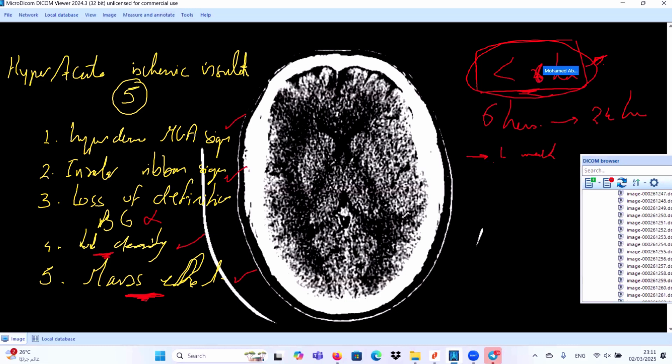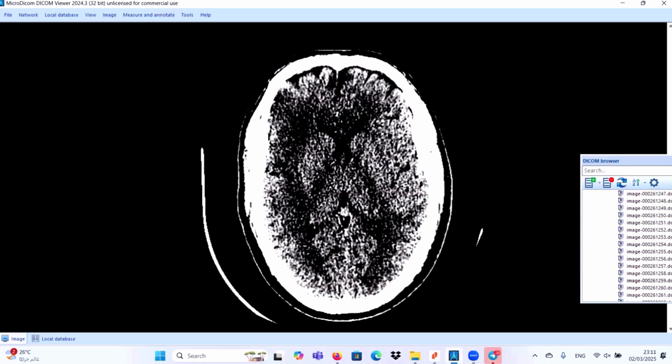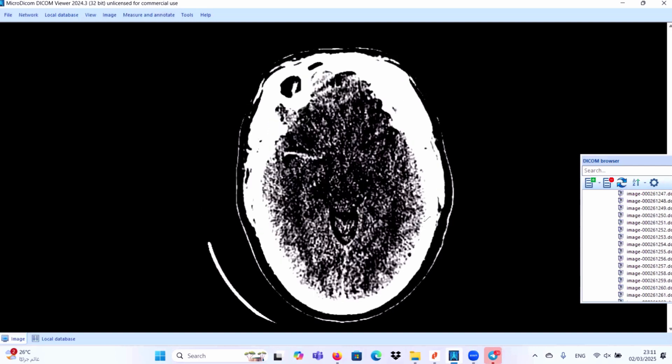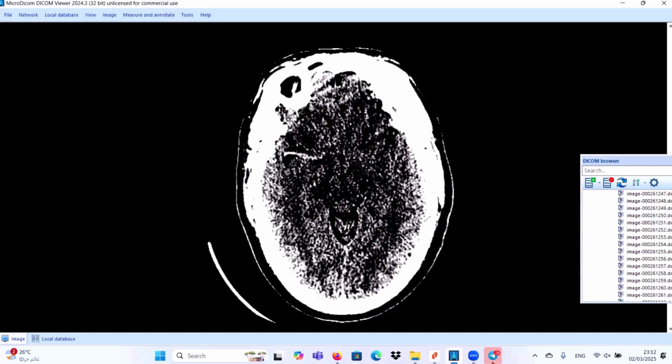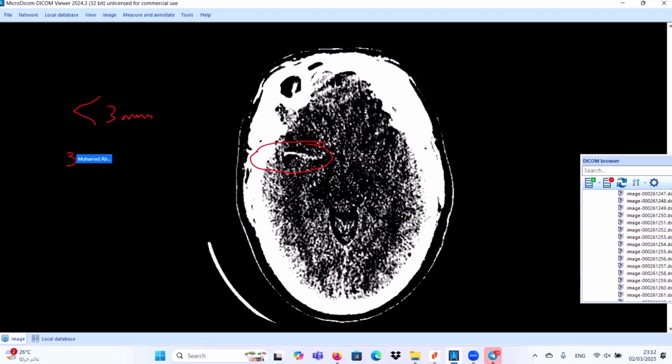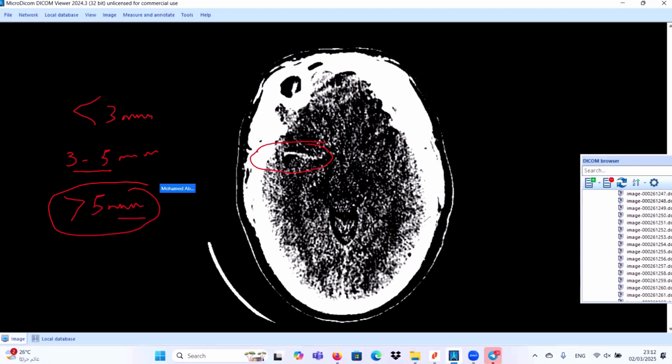Our two learning points or two secret points for highly professional reports: you can measure the length of the acute thrombus along the right middle cerebral artery. Some papers documented that if the thrombus length is less than three millimeters, it is of high favorable prognostic value. Between three and five millimeters in length: borderline. More than five millimeters in length: most likely of bad prognosis. So the length of the thrombus inside the middle cerebral artery is very important.